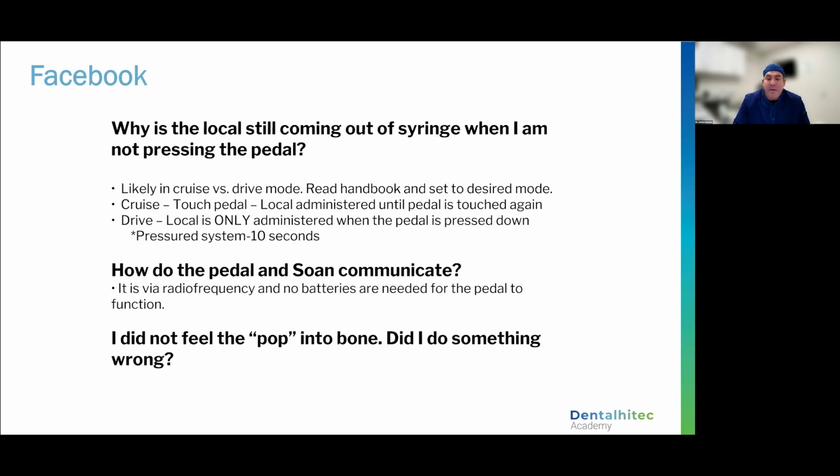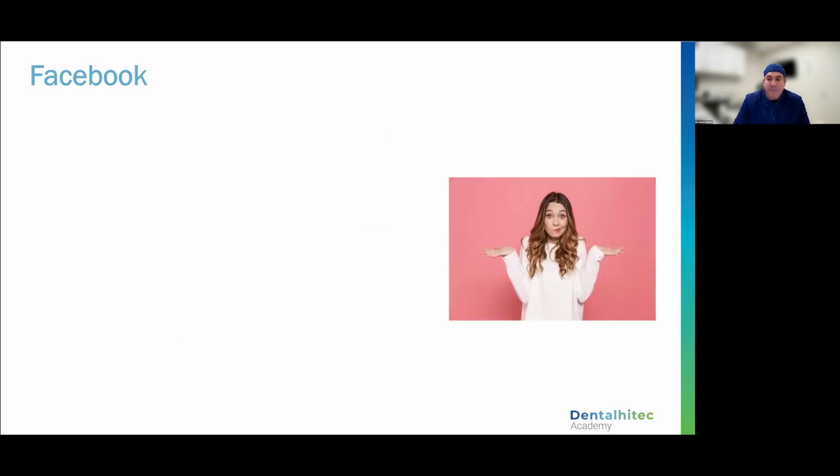Okay. Pop in the bone. We went over that. Under 10, don't expect it. If you have it, you have it. But for patients 10 and above, I will feel it pretty much every single time, except on erupting second molars often. Even for older patients, the bone plate is not very thick there. So even for patients older than 10, you may not feel a pop with erupting second molars.